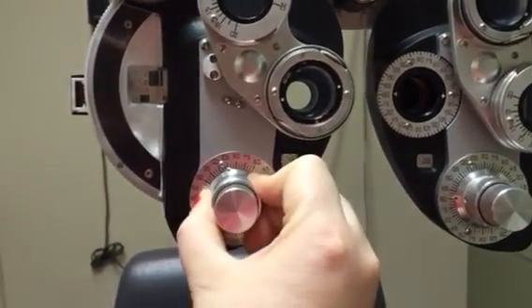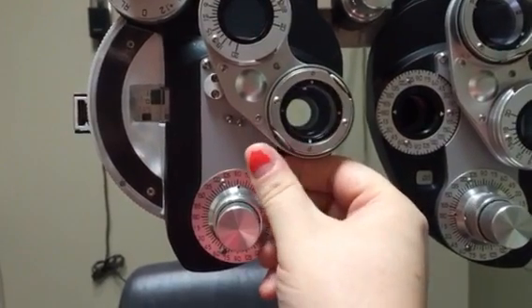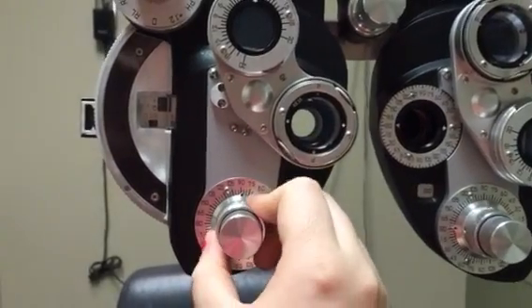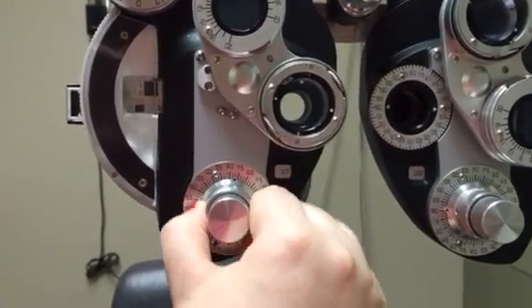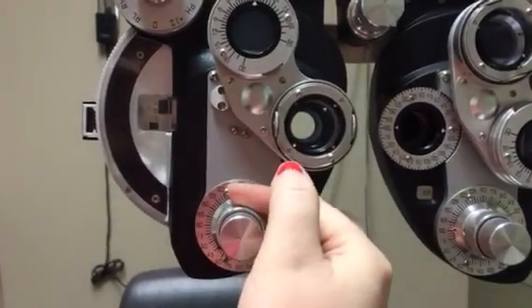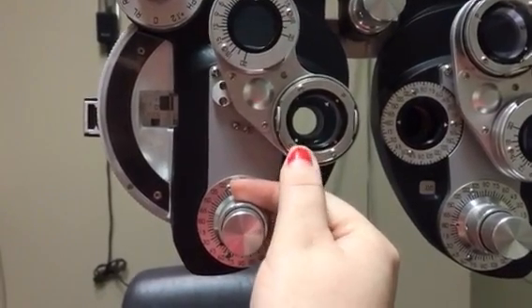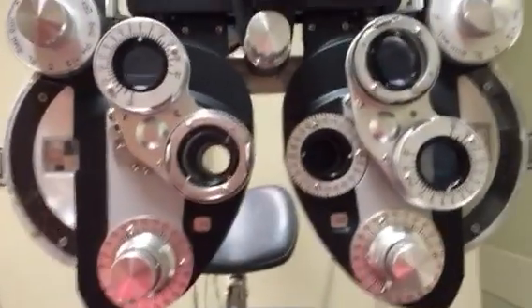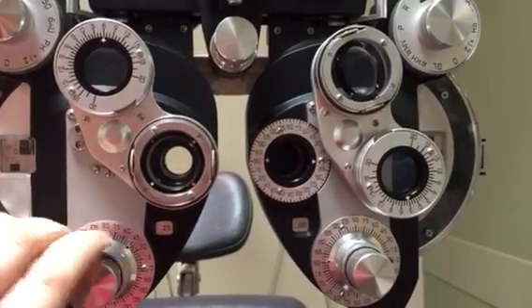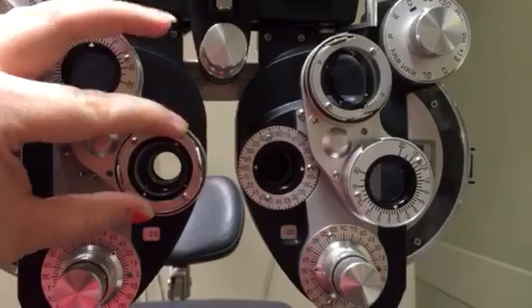Move to 90 degrees and ask again. If they still don't like it, try 45 degrees. This time, let's say they prefer two — that tells us they do want astigmatism correction around 45 degrees. We just need to find out exactly where at 45 degrees they want it.